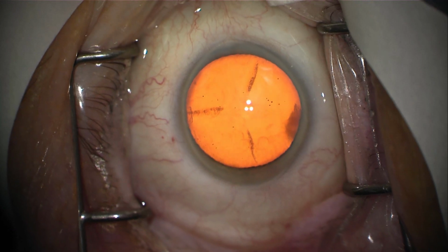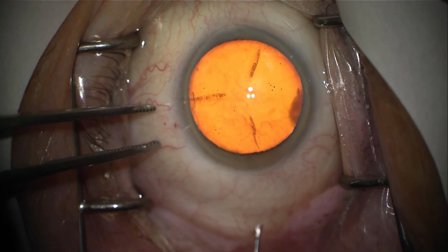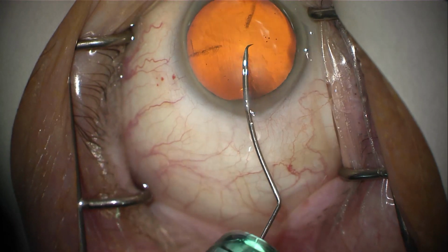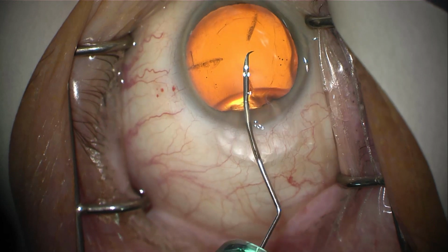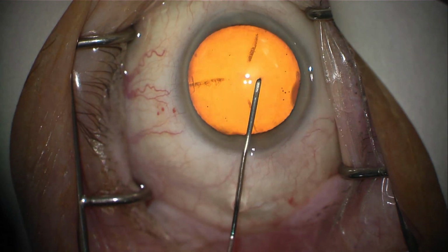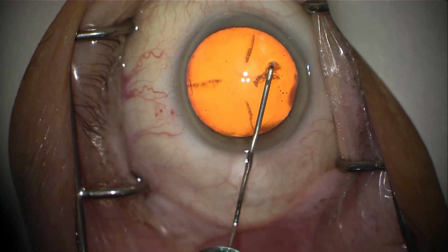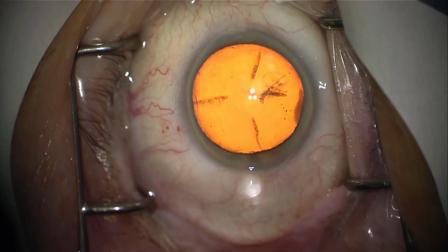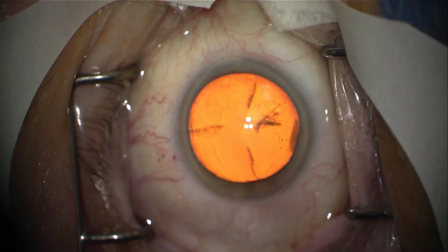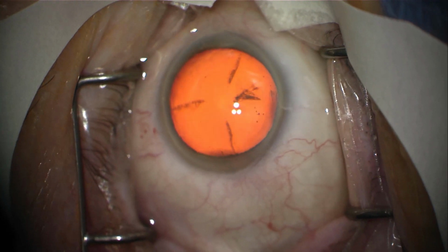Next step that I do is to actually make an incision into the cataract using this very sharp needle point, which you can see. Cataract is about the same size and shape as an M&M. The purpose of this is for me to create an opening on the surface of the cataract. And the cataract sits right behind the pupil, and the pupil is very dilated in this patient, which gives us excellent access to the cataract. Cataract, as I mentioned, is the size and shape of an M&M. What I'm doing here is removing a part of the candy shell so that I can get out all of the chocolate from the M&M without ruining or cracking the rest of the candy shell.